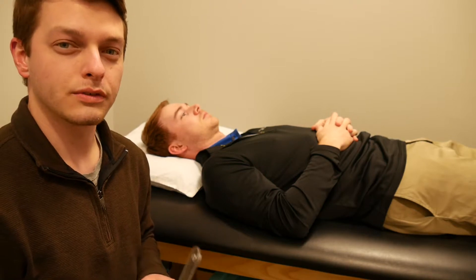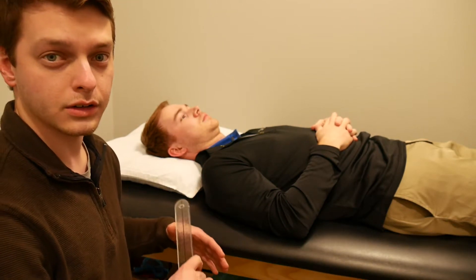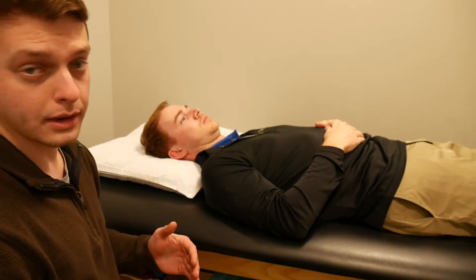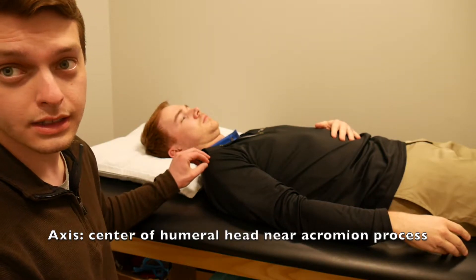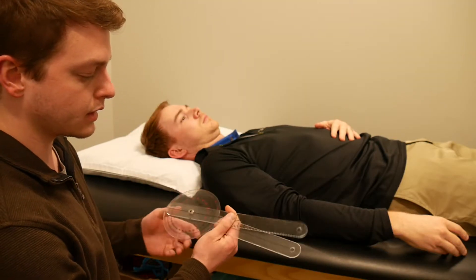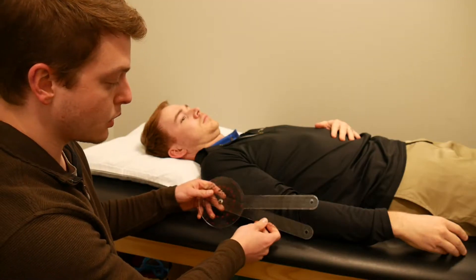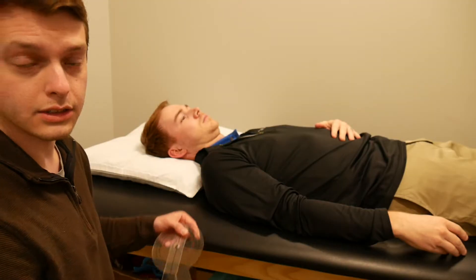First we're going to do shoulder flexion. For shoulder flexion measurements, you're going to have the patient supine on a treatment table typically. You're going to find your normal landmarks — I'm going to put my axis on the goniometer right on the acromion process, the AC joint. The stationary arm of the goniometer should be in line with the patient's trunk, and then the movable arm will follow the humerus as they move into shoulder flexion.